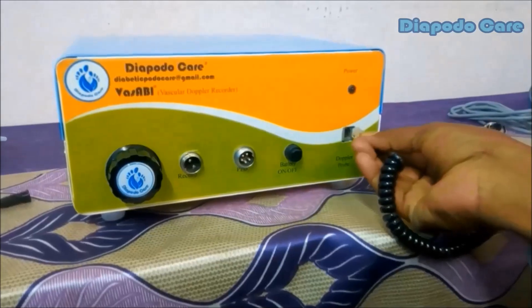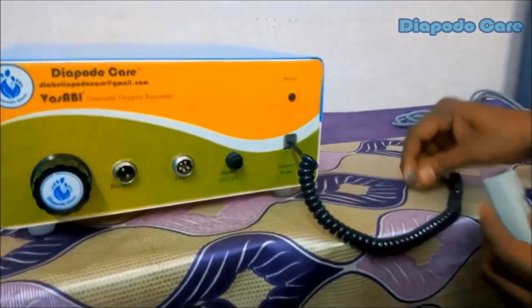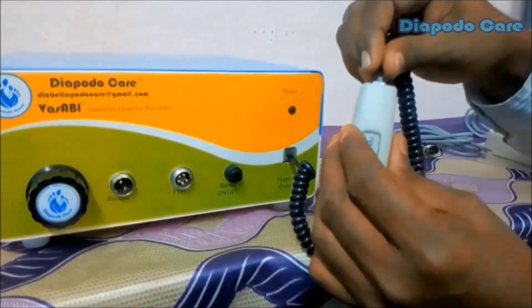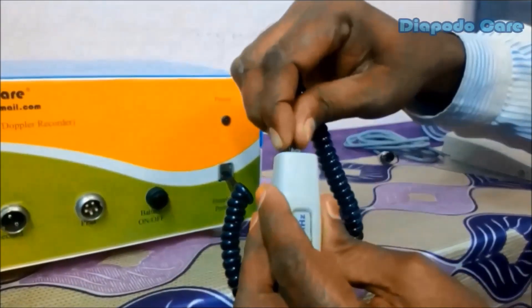Here we are going to learn about the accessory connections with the Vassabi main unit. First, connect one end of the spiral cable into the Doppler probe socket on the front panel of the Vassabi main unit. Then connect the other end to the 8 MHz Doppler transducer probe. Make sure the male and female connectors are correctly matched at both the machine end and the probe end.